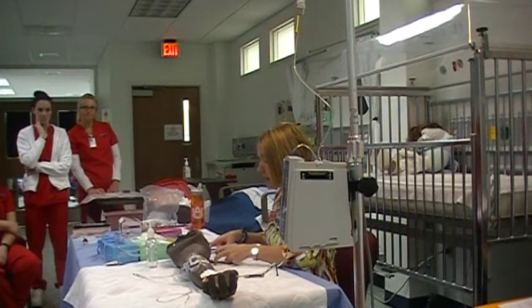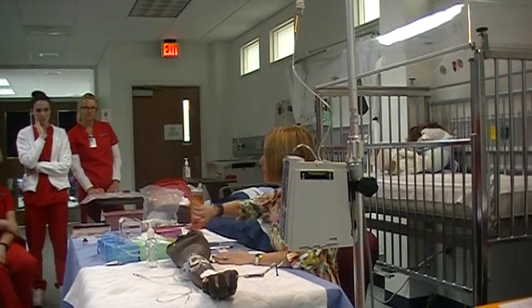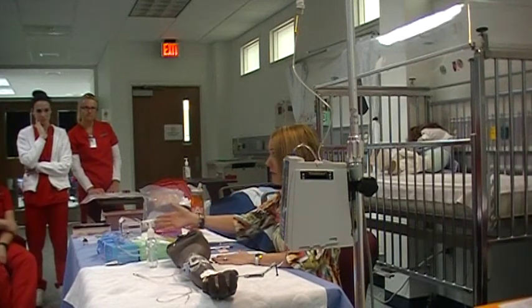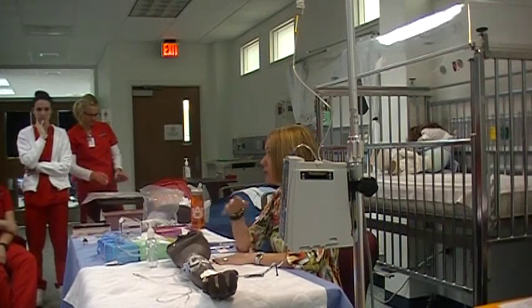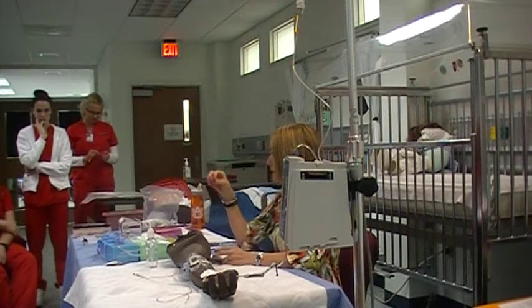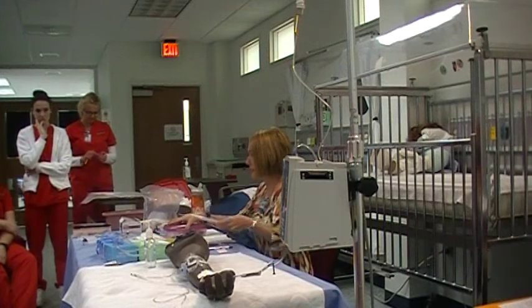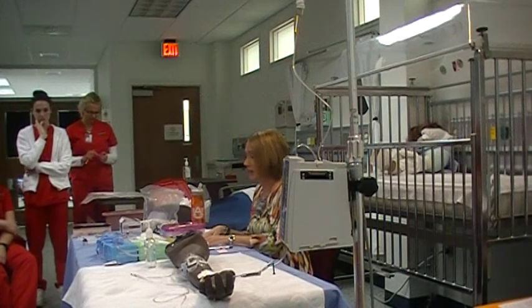Okay. So we're going to go through how I set it up. Half the table is going to be your med room, half of the table is going to be your patient room. So you understand that's going to be the setup of the day of SPD. So this will be our setup, and I'll have it look exactly like this. So you'll go right down the list.